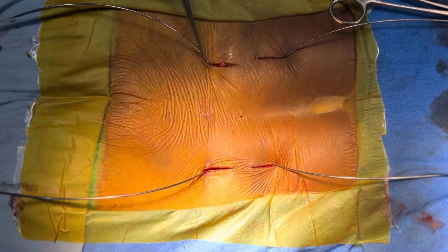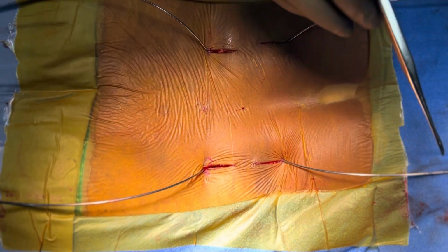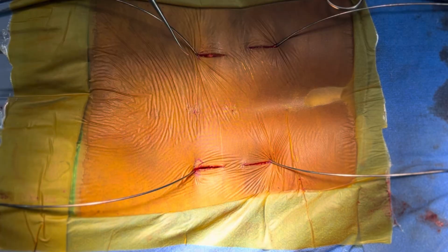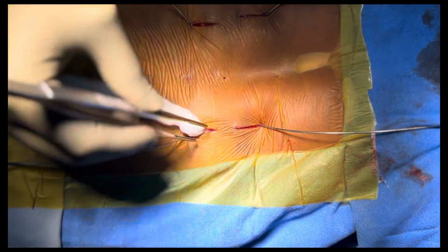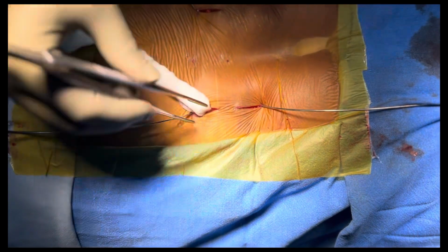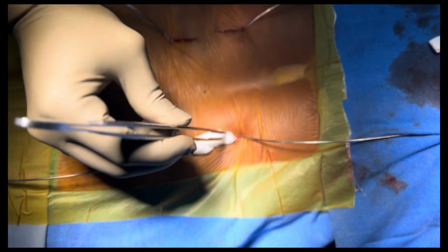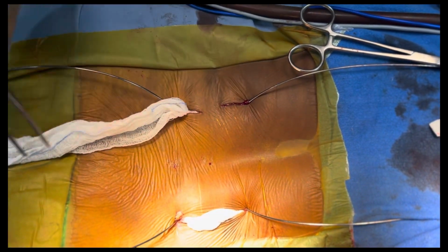All 4 guide wires are placed, and while doing the interbody work you can attach those guide wires to the drapes with artery forceps, so that they do not come in your way. You can put a radio-opaque gauze piece into those incisions to avoid oozing, like this, and keep it like that till you insert the pedicle screws on those guide wires.